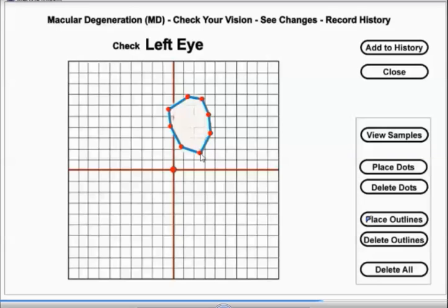Once you have completed putting in the blue lines, click add to history. This will save what you have done for future use.